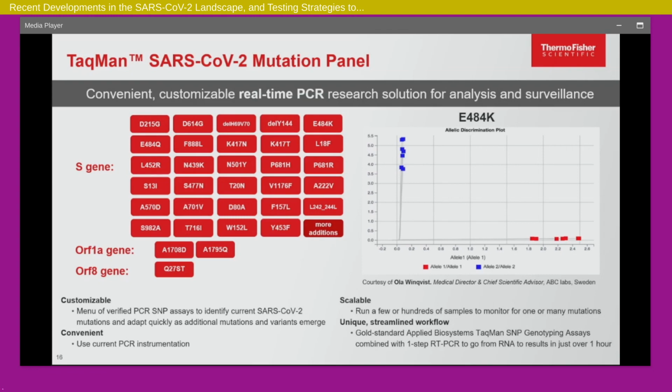Based on that, you can quickly form a panel, pick and choose from here, and make a panel for yourself. It uses the same PCR instrument and the same RNA that you have extracted for diagnostic testing, for calling it positive or negative, and you basically run this panel on the same instrument. It gives you an answer within an hour. So it uses the same technology, same instrument, only now you're getting surveillance information within an hour rather than doing sequencing. And again, I'll tell you how you can complement sequencing for surveillance.